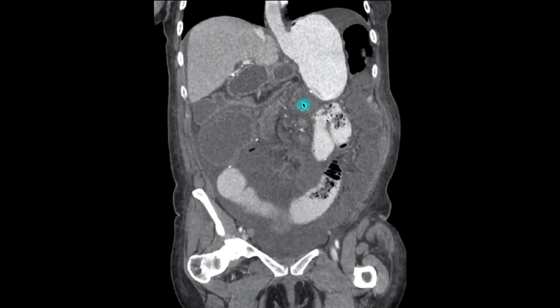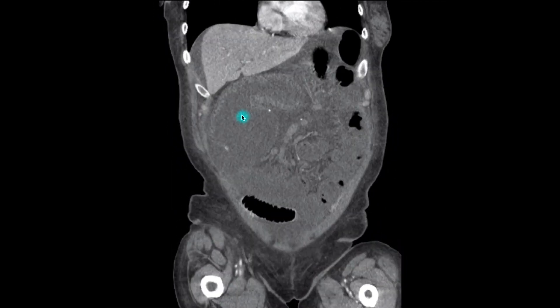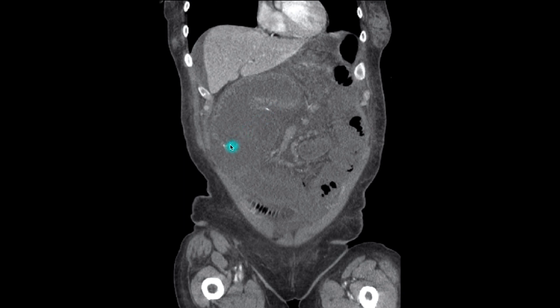Moving anteriorly, we follow the dilated biliopancreatic limb to here. These white lines here indicate the jejuno-jejunostomy.